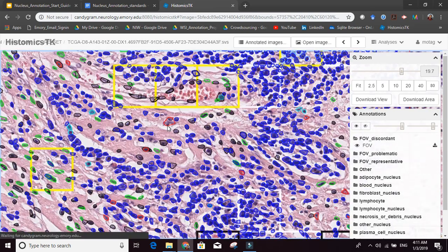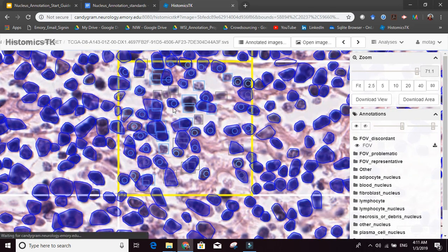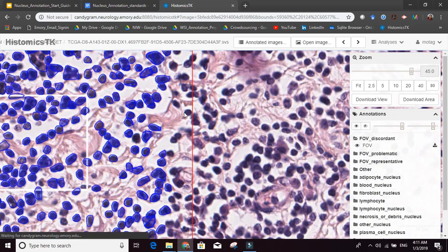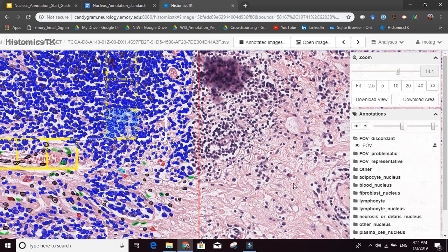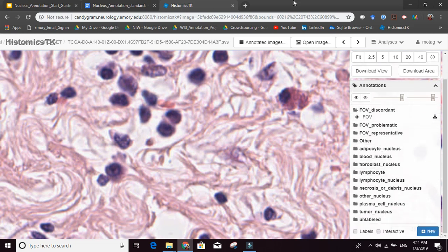We zoom into a field of view, and here is the field of view that Rukaya has, that we annotated and I showed in the tutorial. But remember, before you do any annotations, you need to define all the annotation styles. Again, this needs to be done only once. So the way I'm going to do this is I'm going to go somewhere completely random, completely outside the field of view, and then define all the styles. So how can I define the styles?